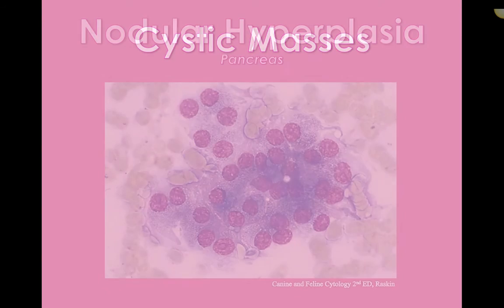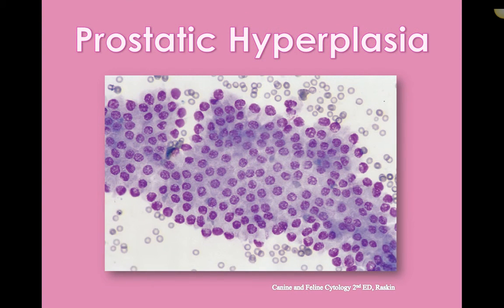So just going back to this slide, there's a big thought process going on. Right away, I would never expect you to look at this and absolutely say, this is prostatic, because A, you're not going to be overly familiar with prostate cells to start with. If you specialize in cytology, you likely will be. And B, this is hyperplasia. We know the common characteristics of hyperplasia, that's what I explained in the slide prior.